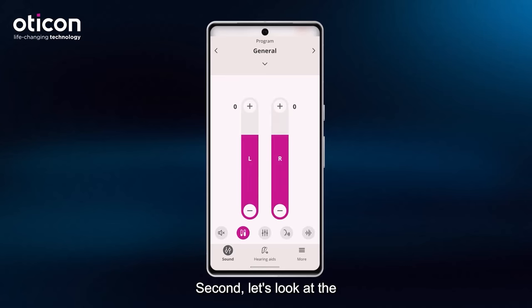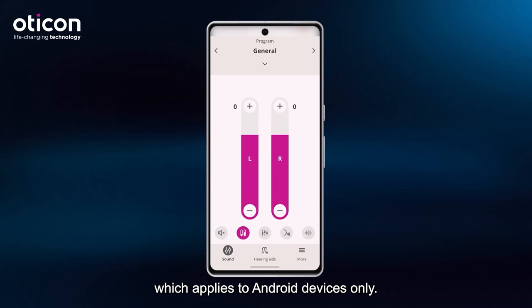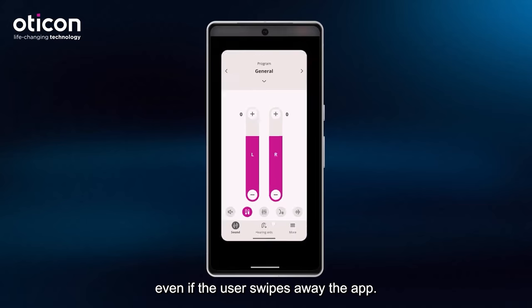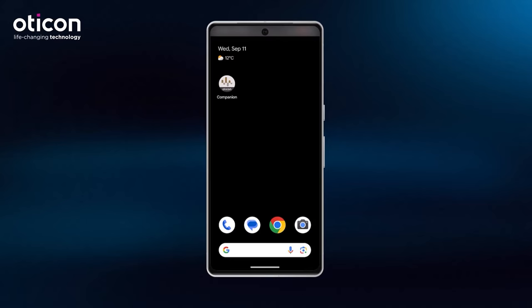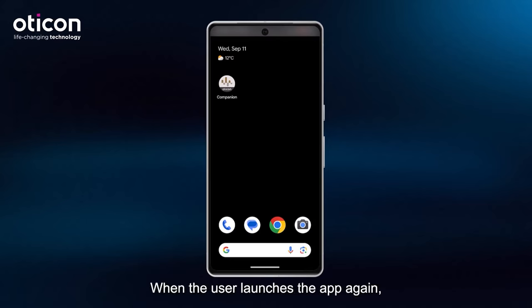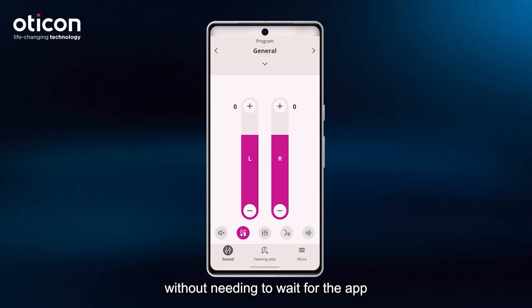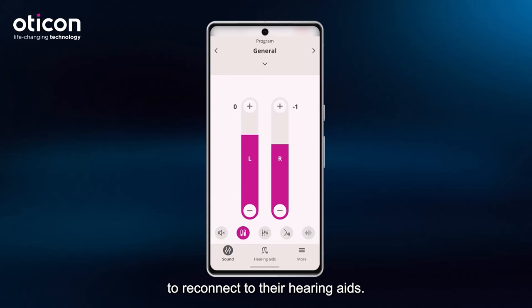Second, let's look at the Keep Connection functionality, which applies to Android devices only. The Keep Connection functionality allows the hearing aids to stay connected to the app, even if the user swipes away the app. When the user launches the app again, they can access the app immediately without needing to wait for the app to reconnect to their hearing aids.